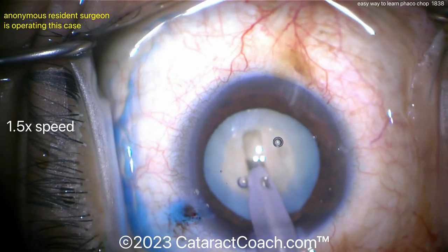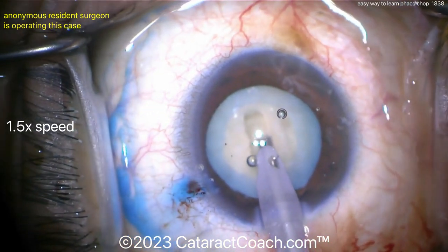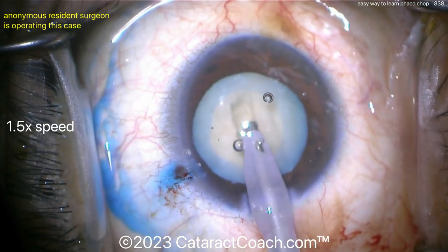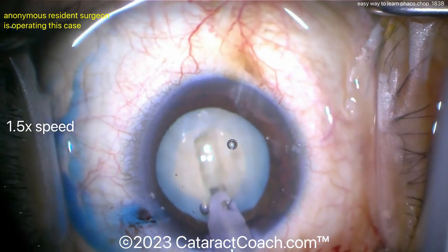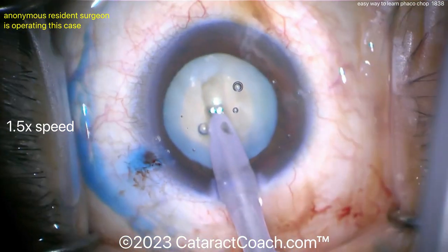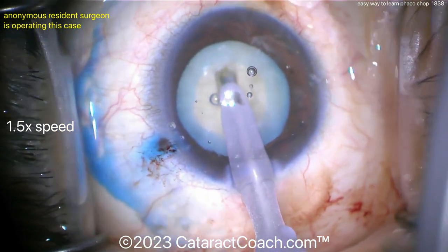The white cataract was chosen for this video because it's easy to see — the rhexis is very easy to see because it's stained blue, and there's the nucleus, easy to see because it's completely white and opaque. There's the groove down the middle. By doing this groove, you're going to debulk the nucleus as well. So do your divide and conquer.